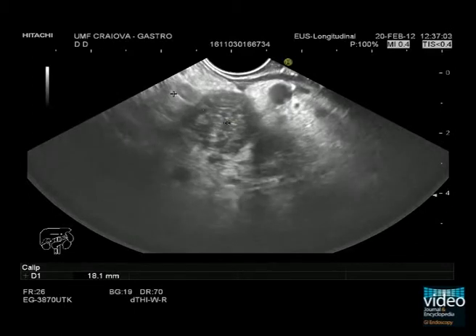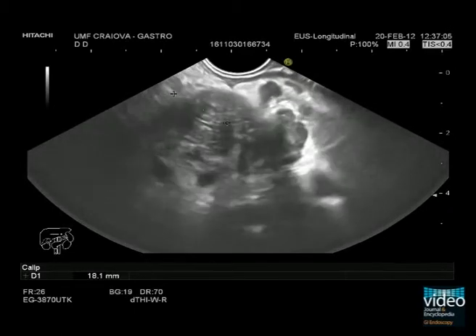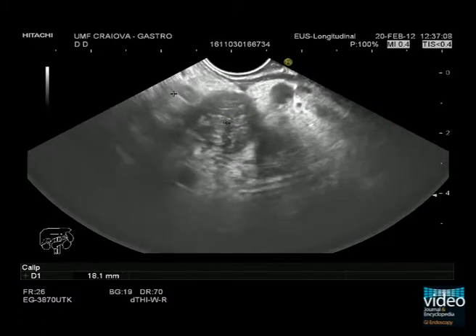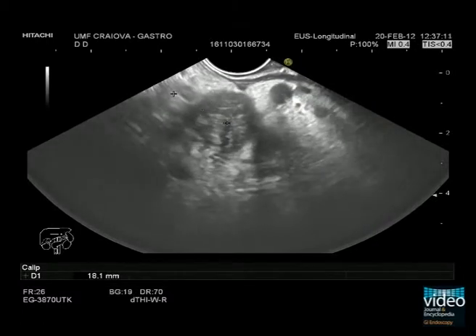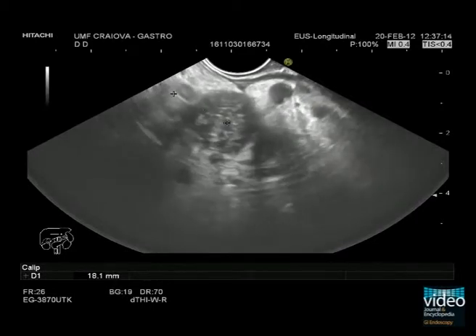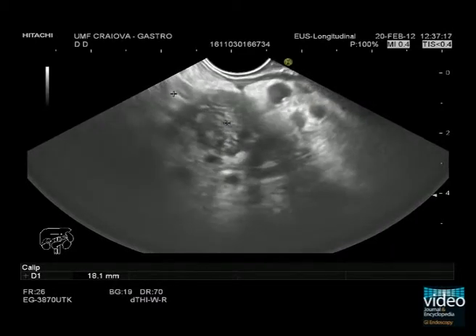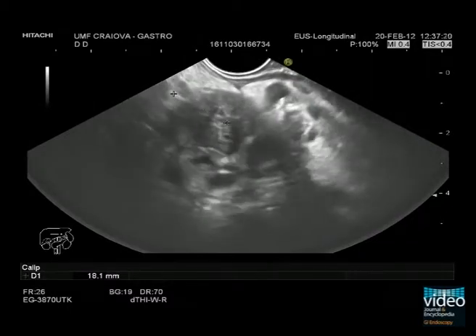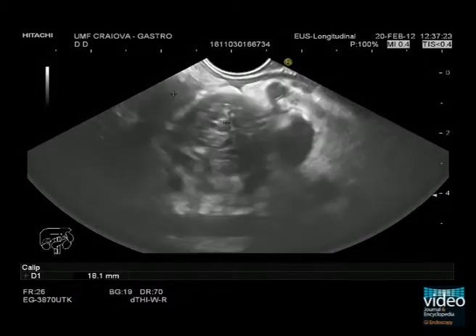A 50-year-old man with epigastric pain and a 5 kilogram weight loss was admitted to the gastroenterology department. Linear endoscopic ultrasound (EUS) was performed for detailed visualization of the pancreas. EUS revealed a hypoechoic mass 3.5 centimeters in diameter, at the level of the pancreatic body and head, with a cystic component.